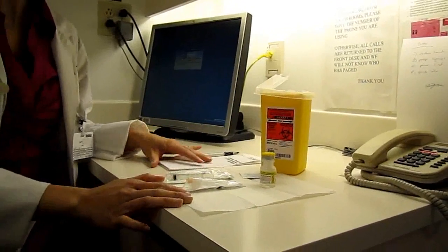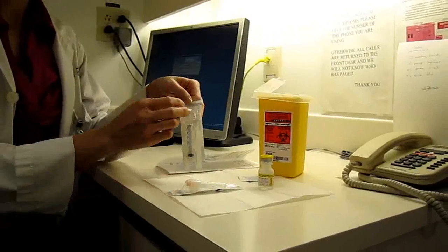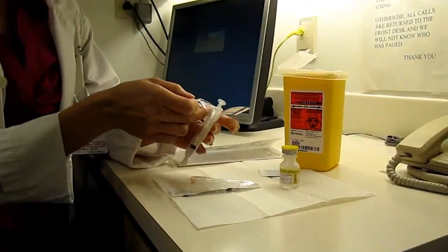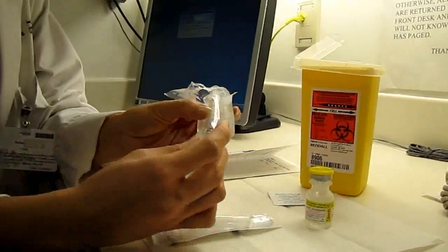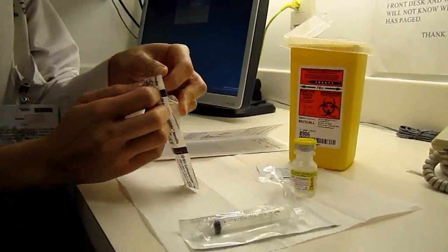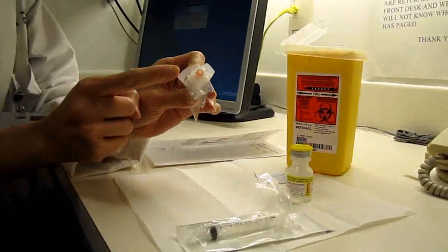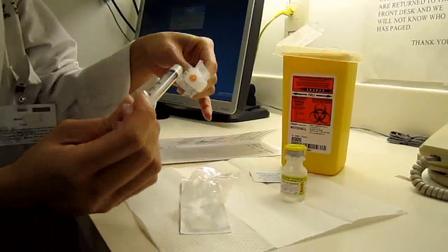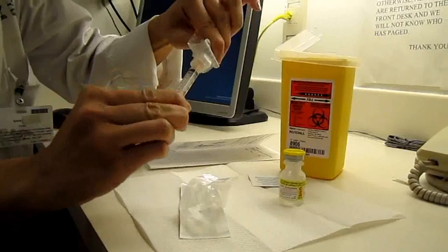Our first step would be to prepare the syringe. We'll take our syringe and we're going to open it up by peeling it back. We're going to leave the syringe in there to protect the tip so we can keep it sterile and not contaminate it. Then I'm going to set it down and now I'm going to take my needle — much like the syringe I will peel that back and carefully open it up without contaminating where the needle joins on to the syringe. And we're going to take our needle and attach it together.